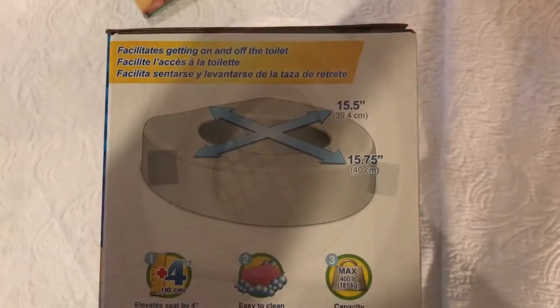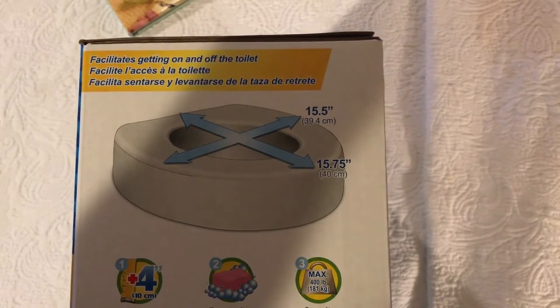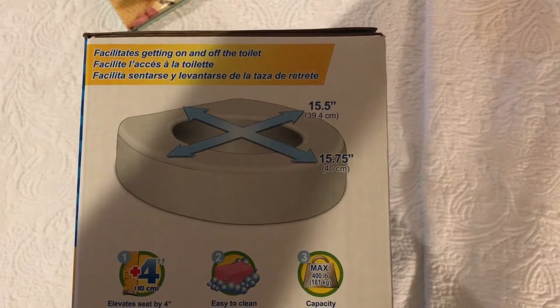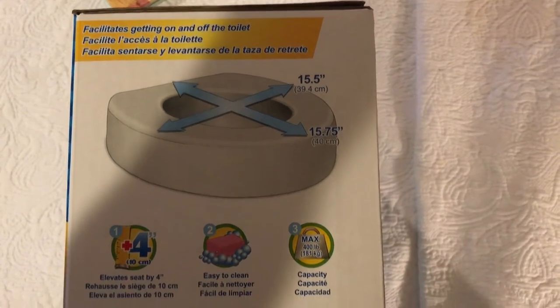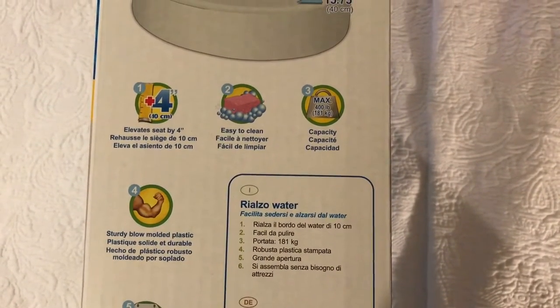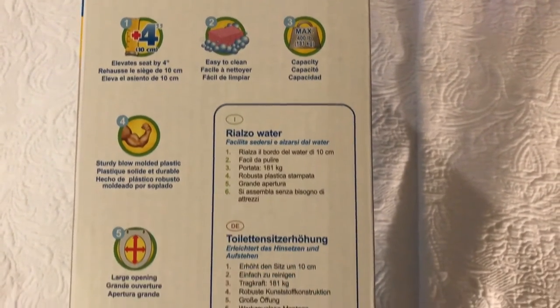Taking a look at the product specifications, we can see that from front to back it is 15.75 inches and across it's 15.5 inches. It's capable of elevating the seat by 4 inches with a 400 pound weight capacity.